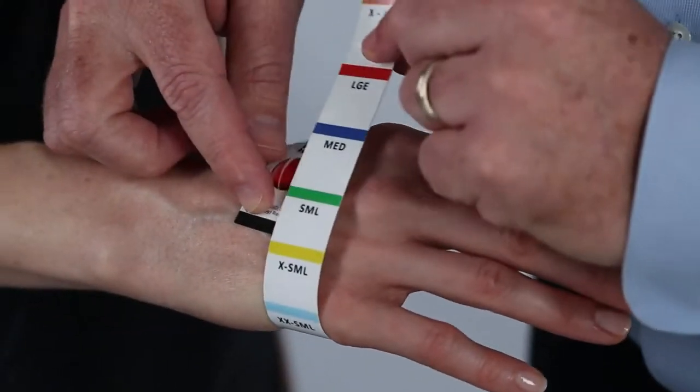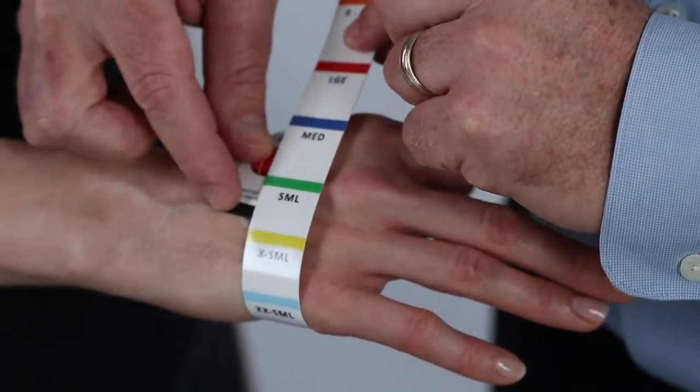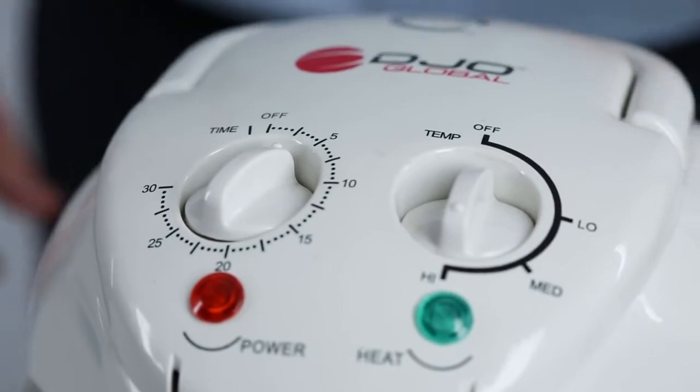Application of the Short Thumb Spica 2. Use the Exos measuring tape to select proper brace size. Heat the STS-2 for 3 minutes.